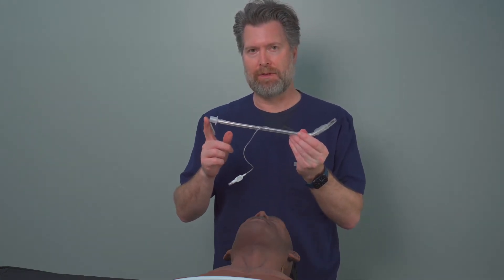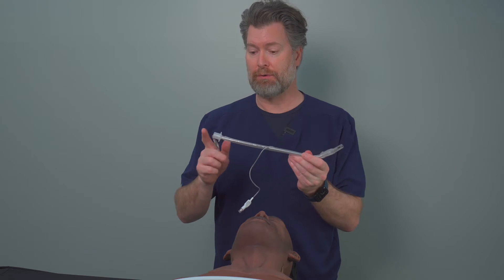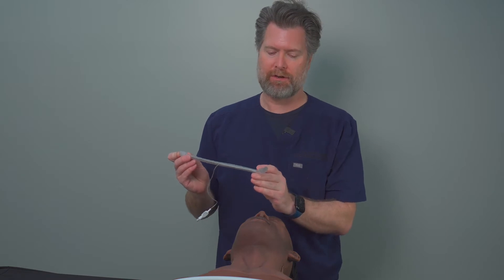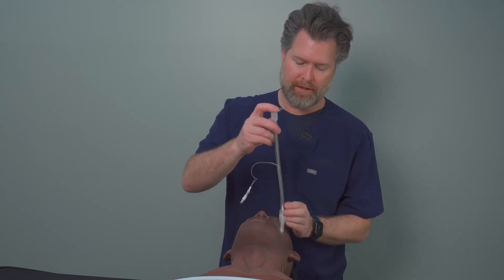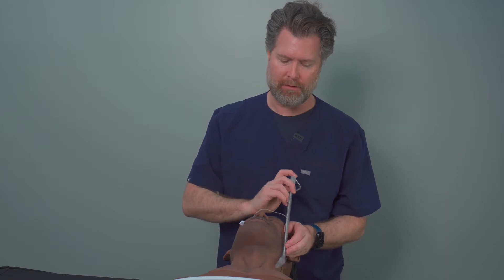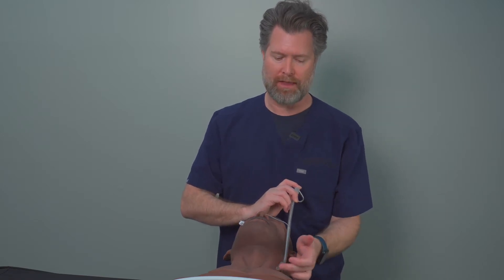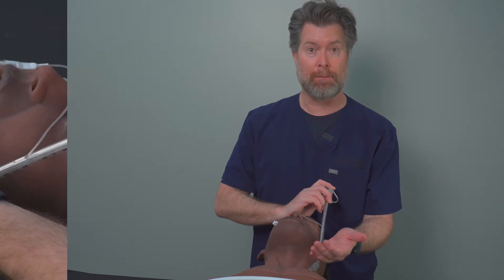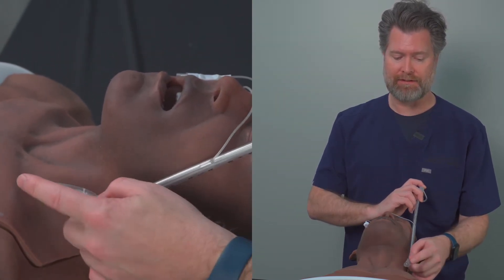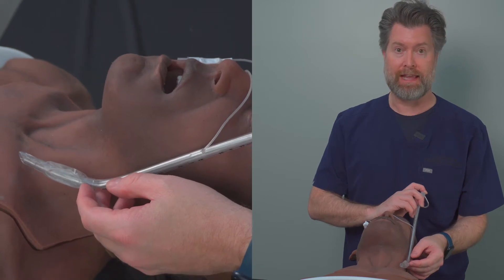Now we're going to focus on some of the techniques you use to deliver this tube using the stylet. One of the things the stylet does is create this 30-degree angle, and when you're headed past the primary curve around the tongue and you come around, you should be able to look at this point here pointing upwards towards the glottic opening, and that should allow you to just guide this tube right up to get to the anterior trachea.